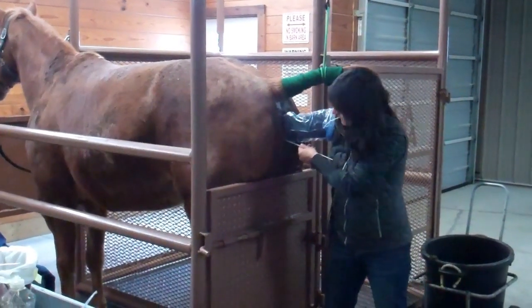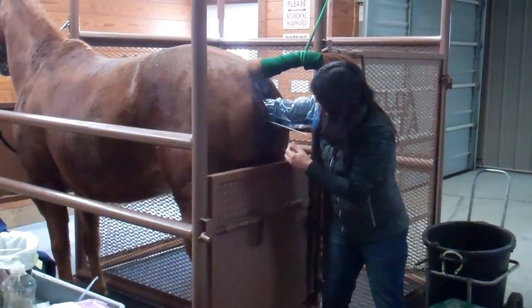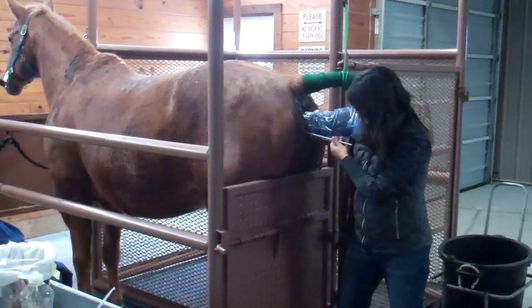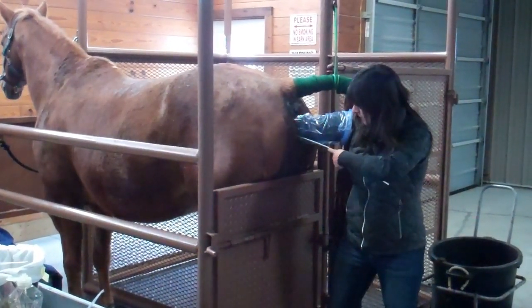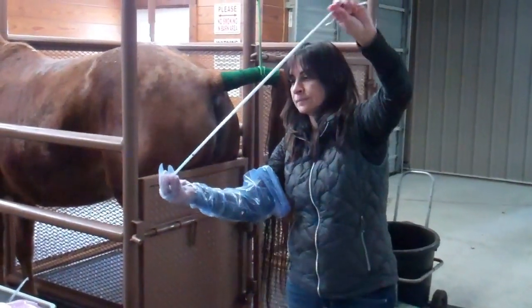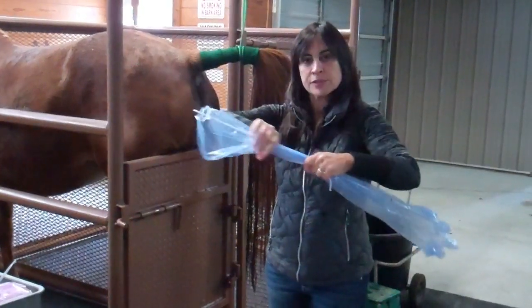I'm just going through the cervix, then I advance my culture. I swab her uterus, let it work a little bit. Now I'm pulling the swab out, bringing the other tube out — and here we are. Now we'll just plate this, let it grow. In 48 hours I'll have the results.